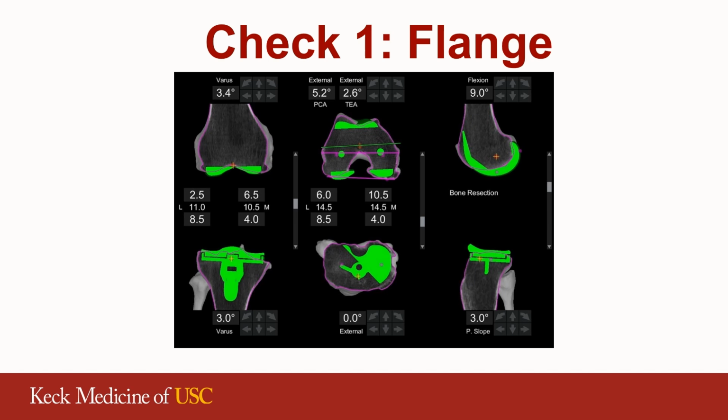This is our plan. We actually haven't made any cuts yet. We've just looked at anatomic alignment. We've planned for mechanical alignment. We've assessed our degree of deformity, and then we've made small changes so that we can recreate rectangular and then symmetric extension gaps. And then we'll go back and check each of these adjustments in 3 planes on both the femur and the tibia.